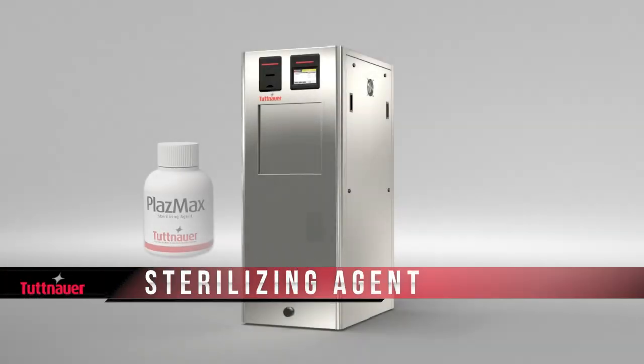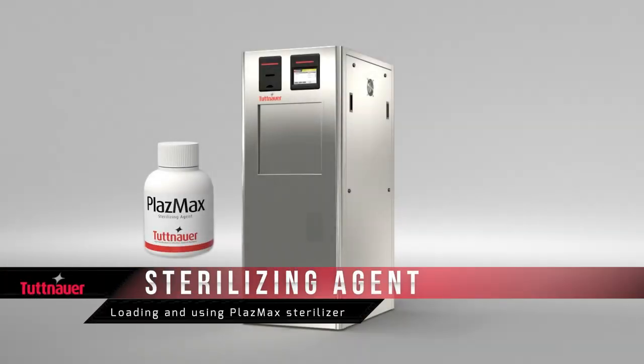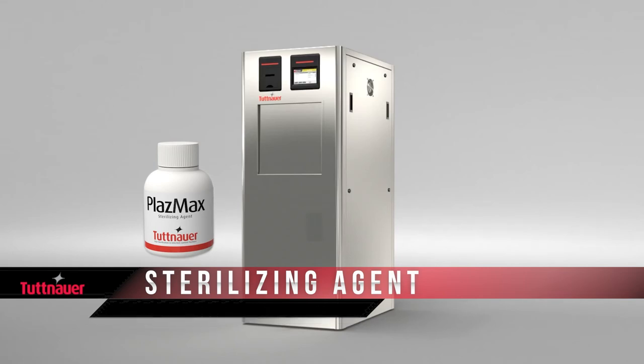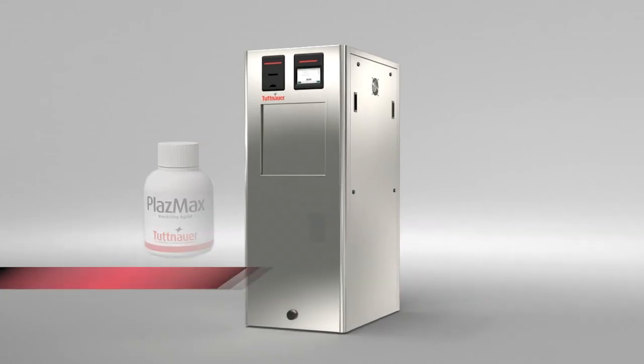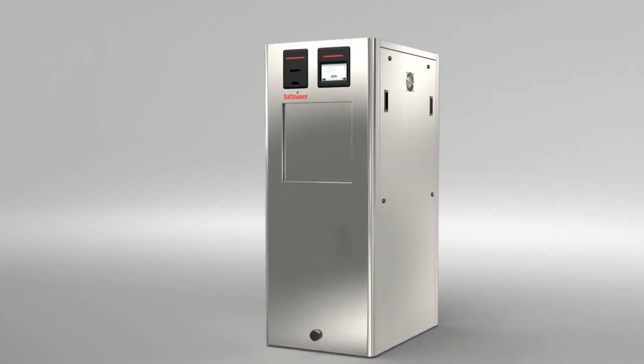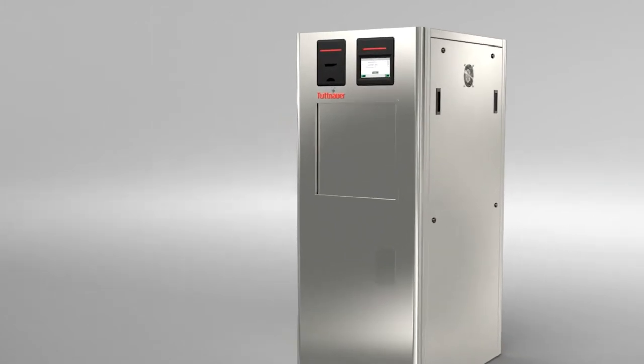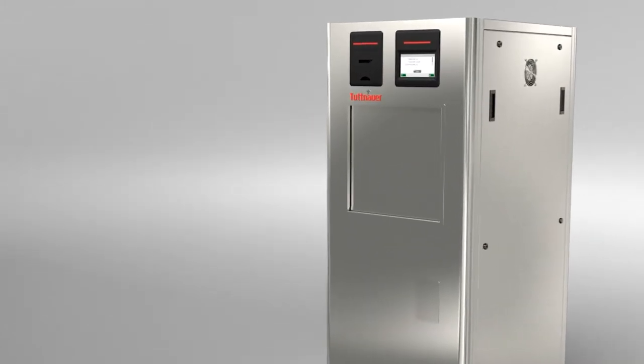Tutanaurs eco-friendly non-toxic sterilizing agent is required for your Plasmax operation. Use Tutanaurs sterilizing agent only.